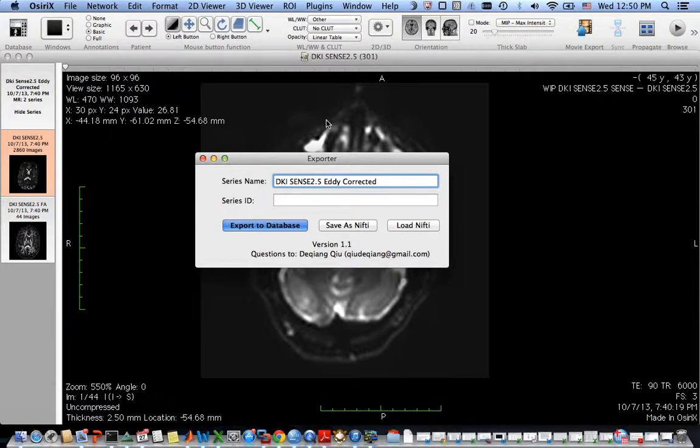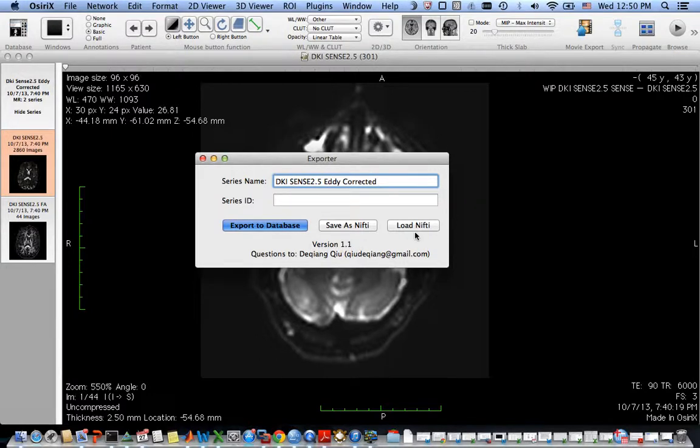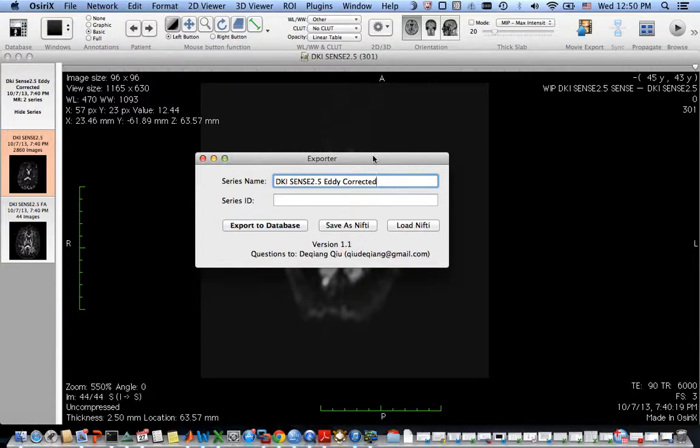So for this plugin to work, the template image has to have the same metric dimensions as the loaded image. By doing this, you basically retain all the DICOM information from the template image.